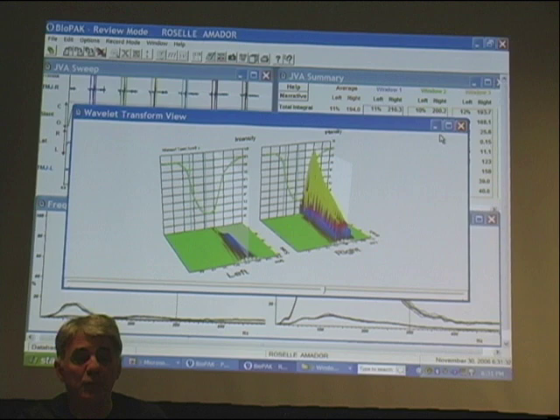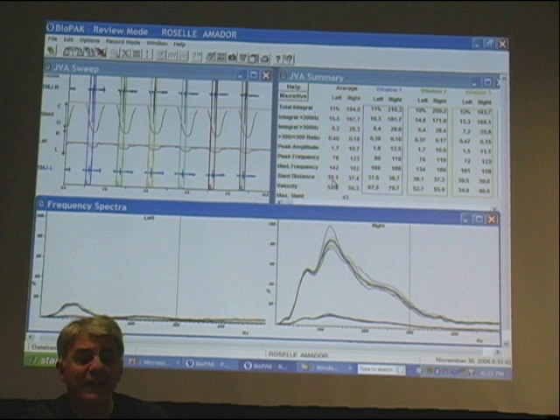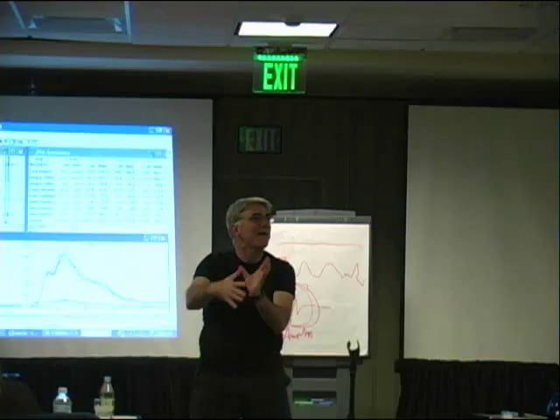It occurs at a slant distance of 37 millimeters, and her total opening was 43. So she's very late.